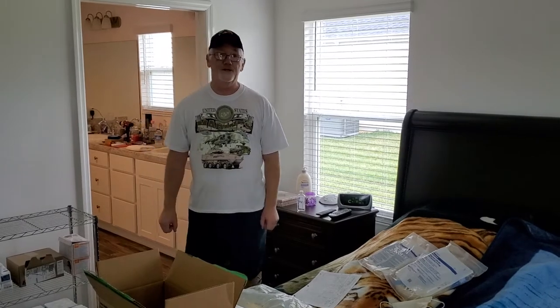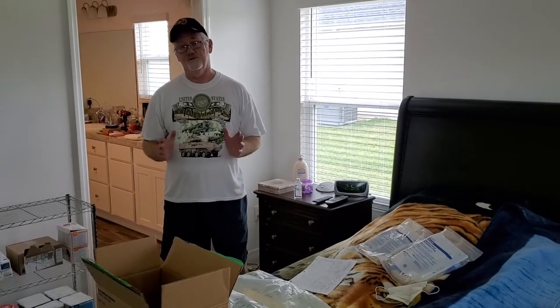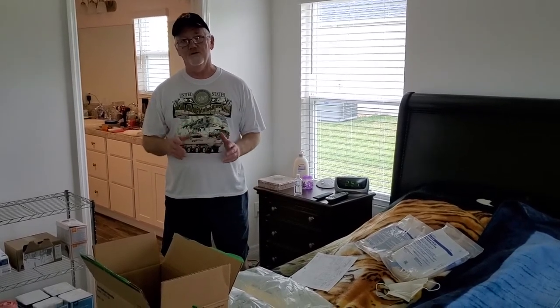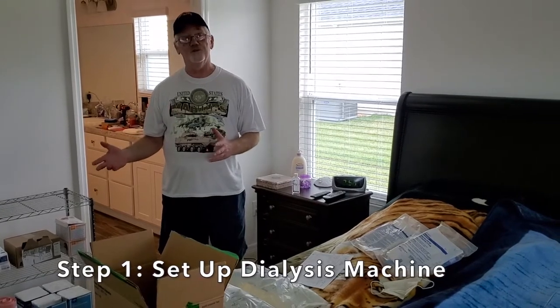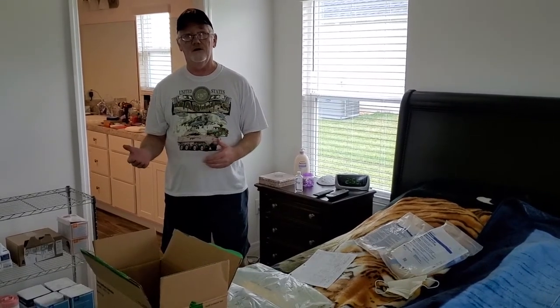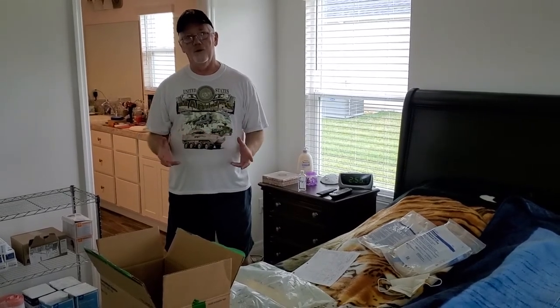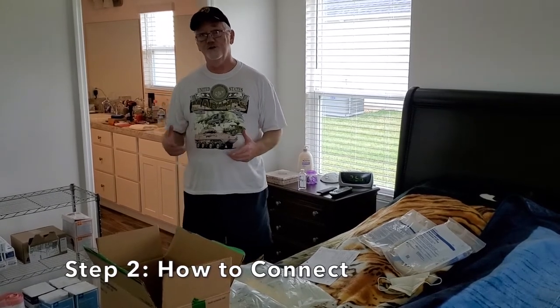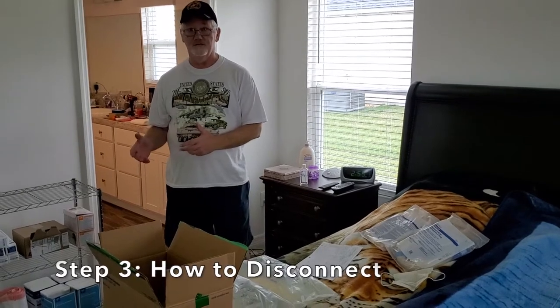Hey everybody, we're going to be doing a series of informational videos on peritoneal dialysis. We're going to show you three different videos: one to cover how to set up your dialysis machine, or cycler as they call it — that's part one. Part two is going to be how to actually connect to your cycler, and part three will be how to disconnect from your cycler.